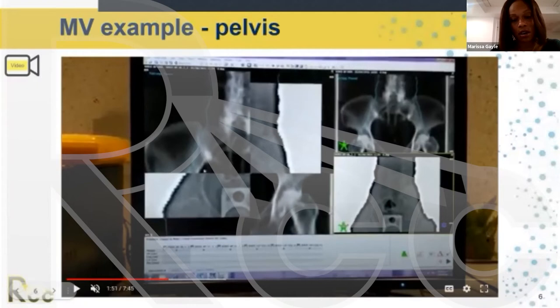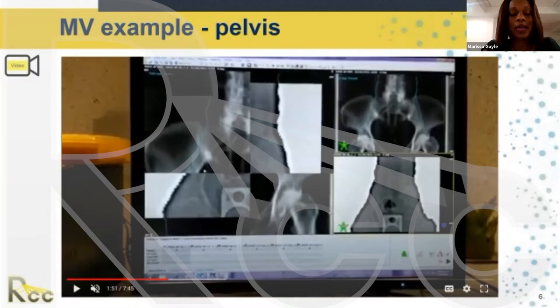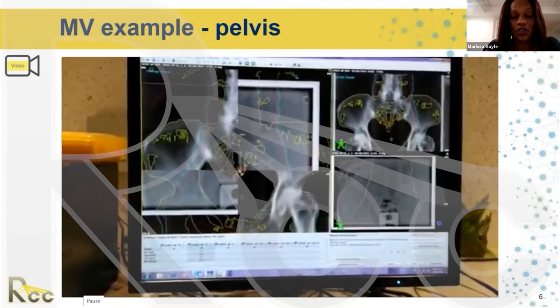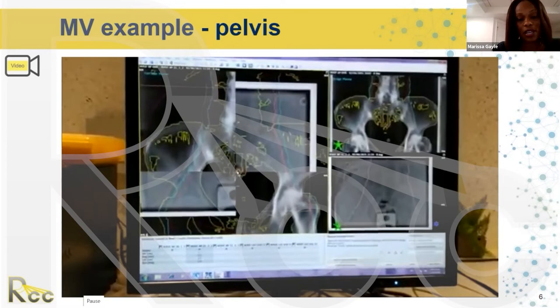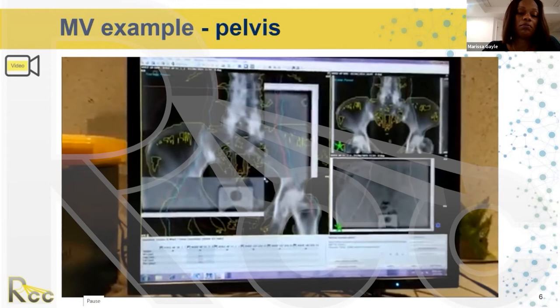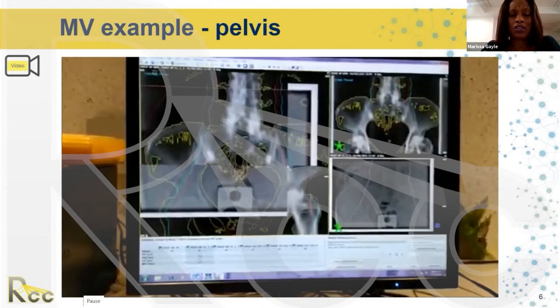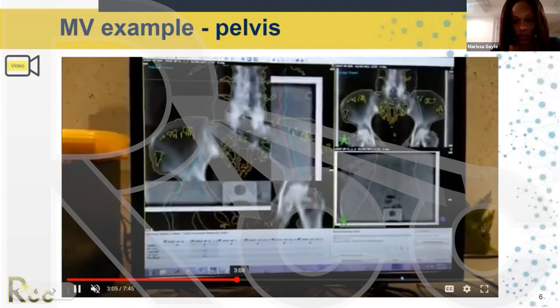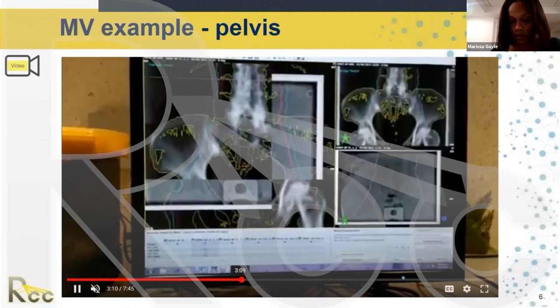Pausing here — on the image taken today, this is the edge of the pelvic brim, but on the DRR, this is the edge of the pelvic brim. We can see there needs to be a shift — the isocenter needs to move to the right. As they manually shift it, we see both images now mirror each other for the left-to-right alignment. The DRR is now matching the image for the left-to-right shift. They're still checking and will then verify the superior-to-inferior position.